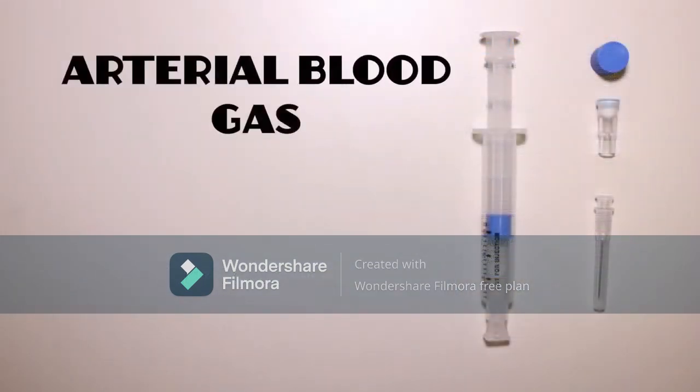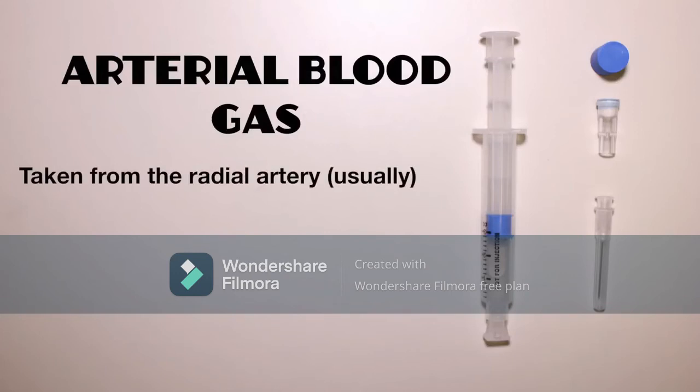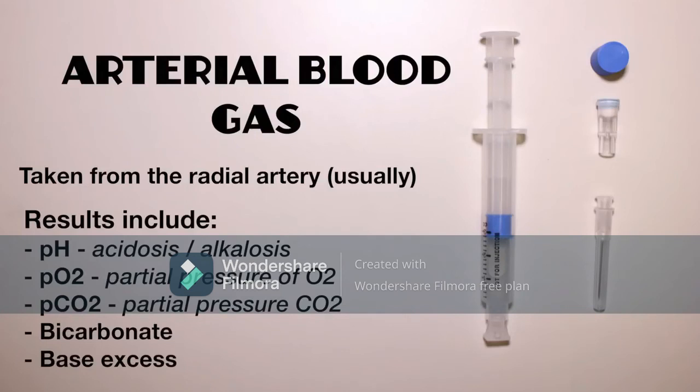All of the tests described so far can be performed on venous blood samples. An arterial blood gas sample is typically taken at the wrist from the radial artery. This test provides values for pH, oxygen content of blood reported as PO2, carbon dioxide content of blood reported as PCO2, bicarbonate, and base excess. Arterial blood gases provide important information in acutely unwell patients to allow assessment of illness severity, clarify the diagnosis and guide management. This test is collected in specific syringes and must be taken to the lab within about 20 minutes of collection for accurate processing.